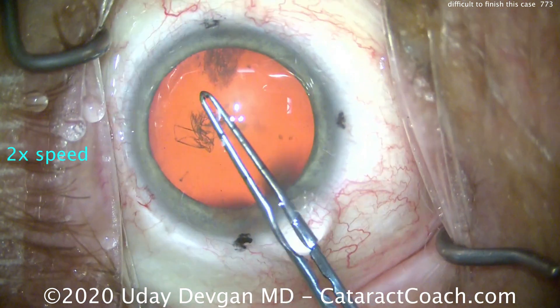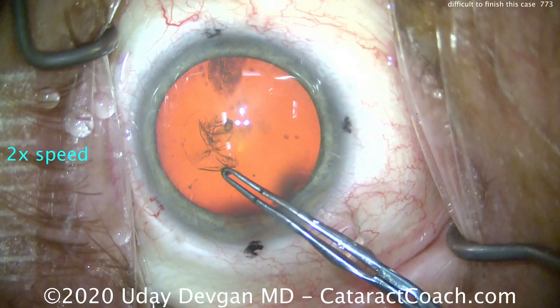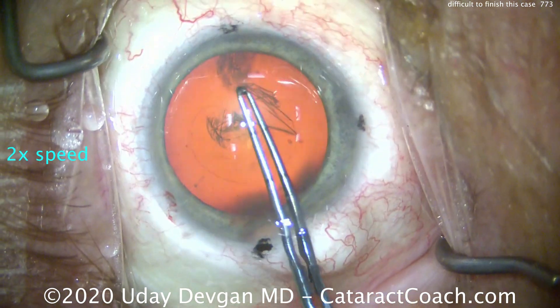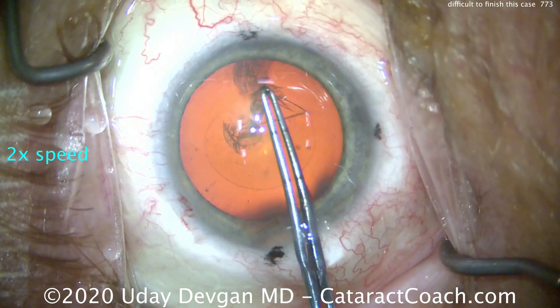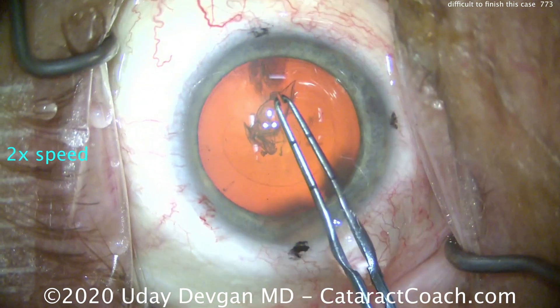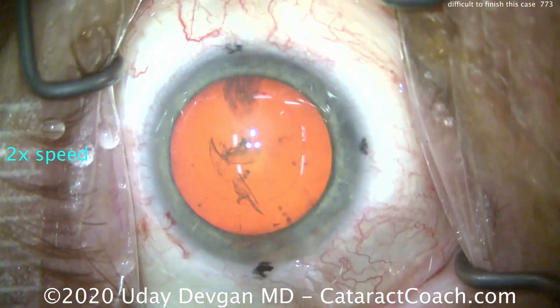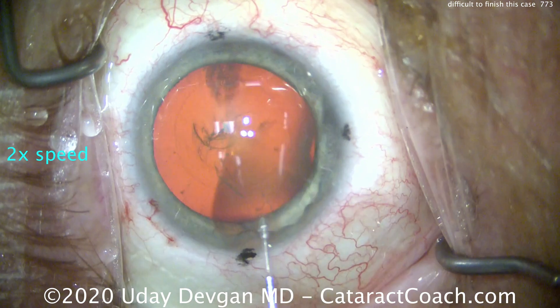Creating the capsulorhexis. The capsule looks good — nice and tight, no evidence of loose zonules. So we create a nice round capsulorhexis. We're looking good. So where's the challenge going to be? Why is this going to be so difficult and challenging?